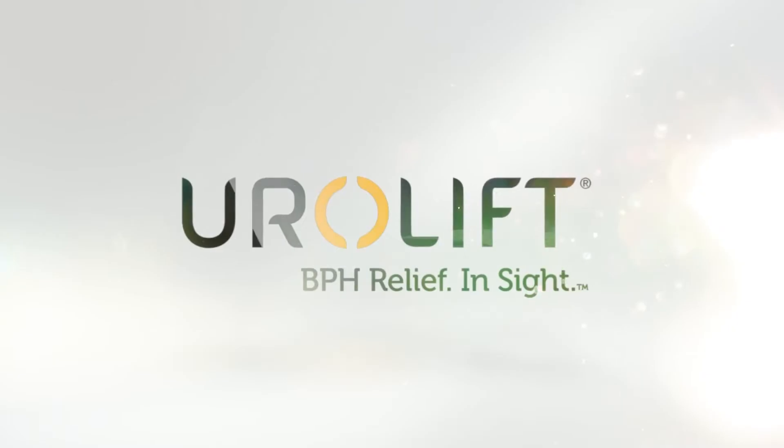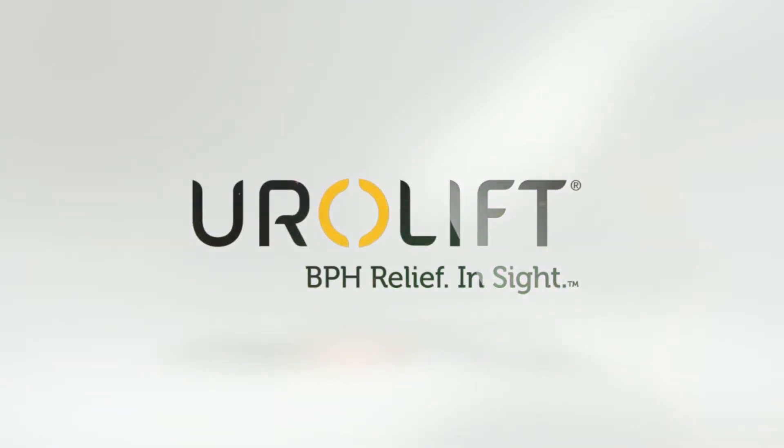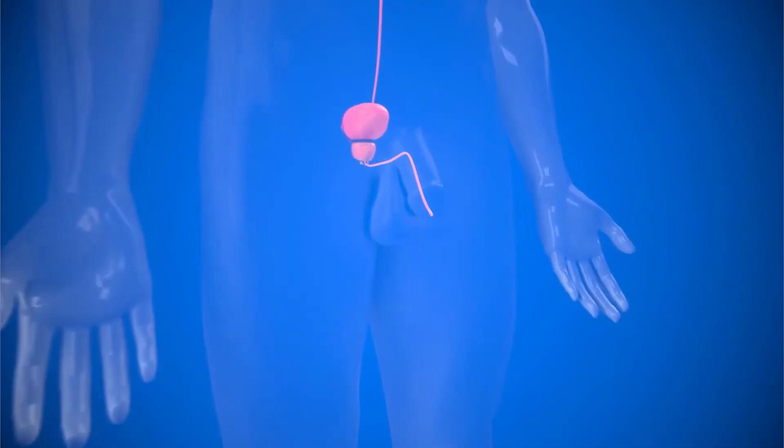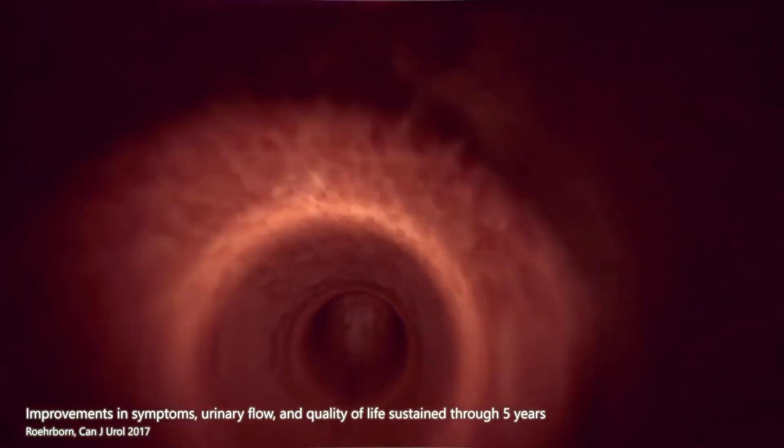The UroLift System is a proven, minimally invasive procedure designed to treat men with an enlarged prostate caused by benign prostatic hyperplasia, or BPH. It has been shown to relieve urinary symptoms and improve quality of life, with minimal side effects.